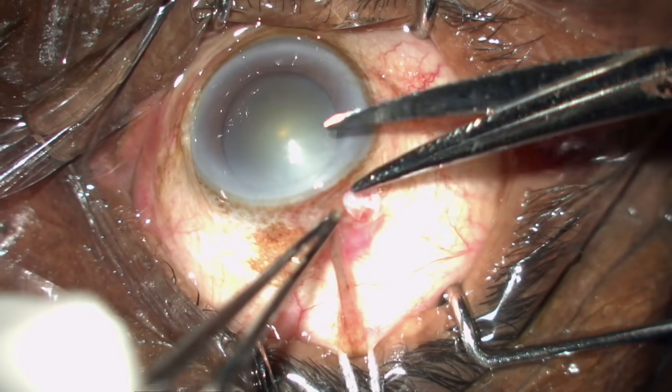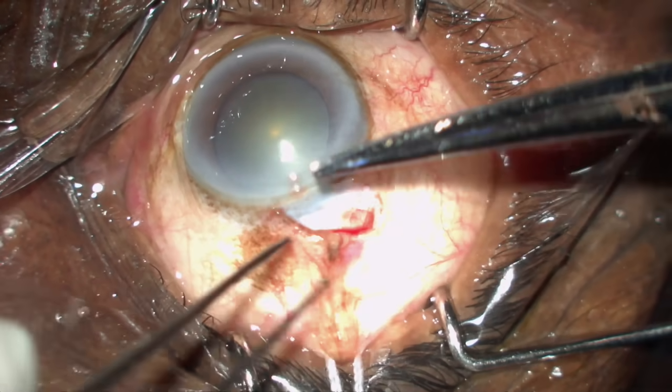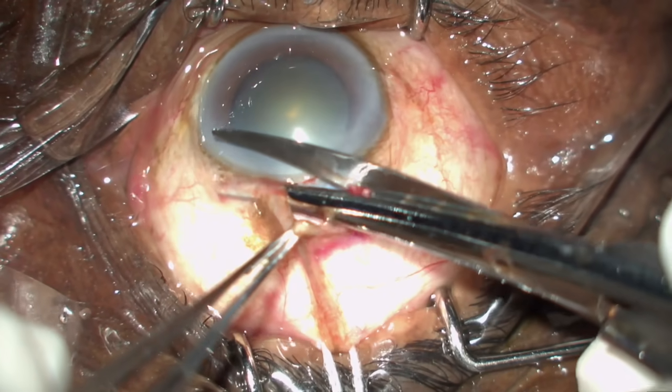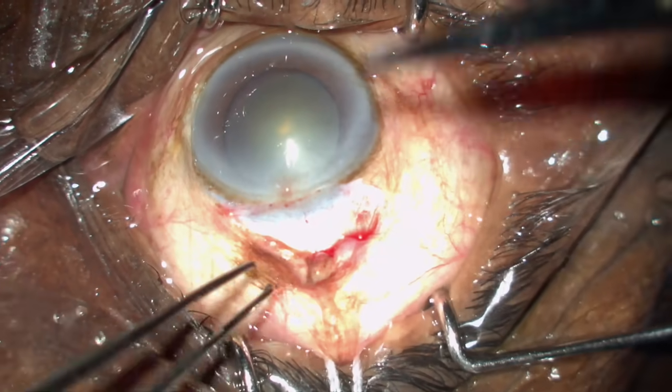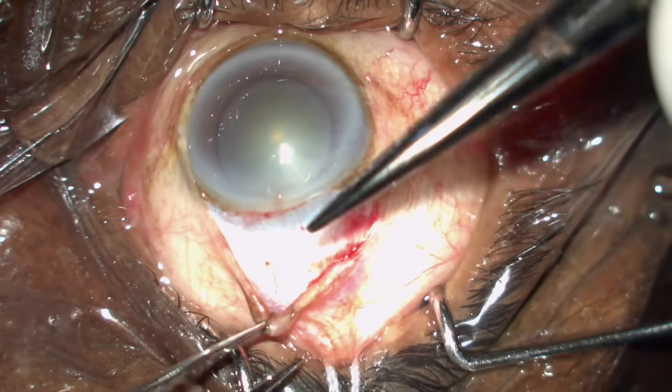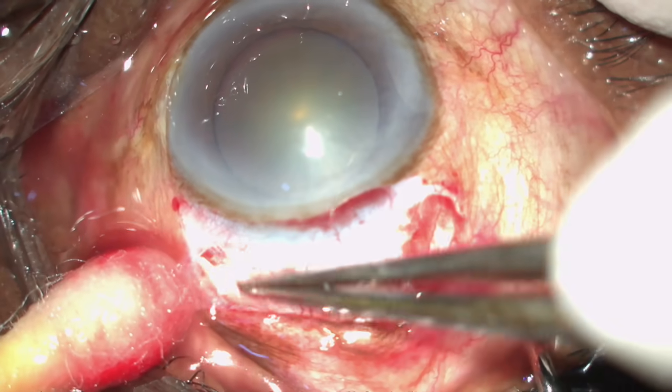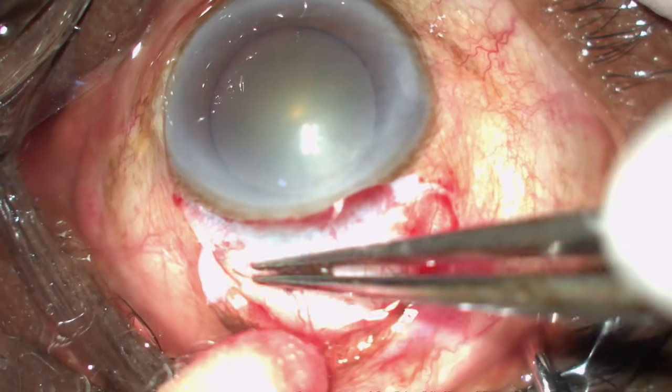While cutting, push towards the cornea and cut so that you expose the blue zone properly. Always use minimum cautery — just the bleeding vessels. Do not go too near the cornea as you might damage it.